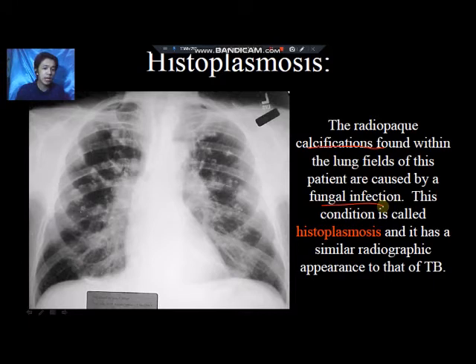Okay, so that is why medical history of the patient is very important. So mga tanong kita, ma'am, nganong giubo man ka, nganong nagkasakit man ka, nganong magpa-x-ray man ka. Okay, so that the radiologist also will try to connect the condition of the patient with the radiographic appearance of the patient. So pagtanaw sa radiologist nato karon, there are consolidations, patchy appearance, so pneumonia. Okay, so what is the main cause of pneumonia dayon? So dito na siya based sa history of the patient.